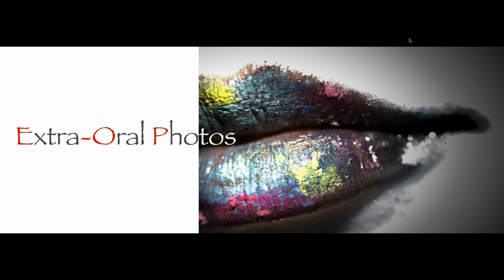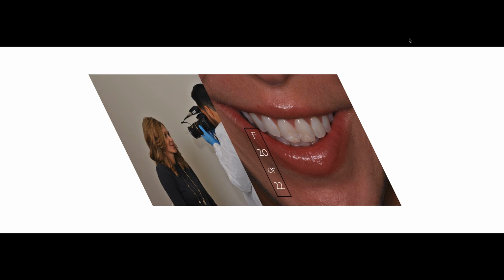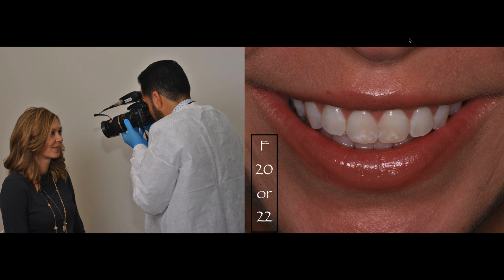Okay, so from the full face photo, now we're going to go to the extraoral photos. So now I'm going to be closer to my subject. I would say I'm probably 50 centimeters away from the patient at this point. And you can see I'm holding my camera. The patient has the head in the right position. I'm going to count to 3, and I'm going to ask the patient to smile.